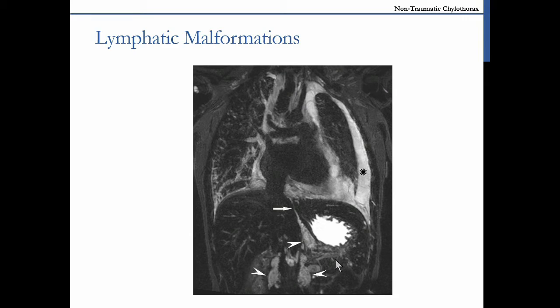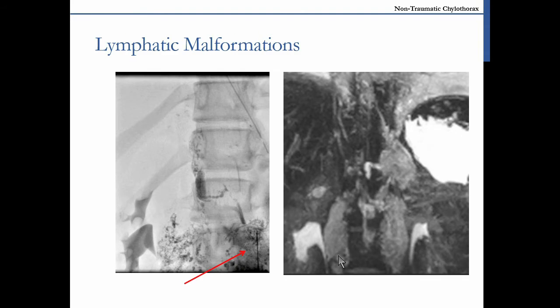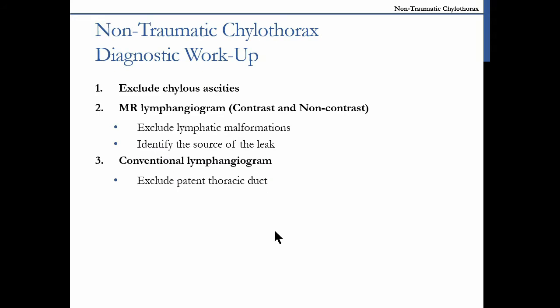It's not here. We have another 37 new patients with idiopathic chylothorax that were treated with the algorithm I will show in a sec. So what do you do with these masses? You inject glue, or sometimes you just puncture with a needle, they bleed, and they close the duct.